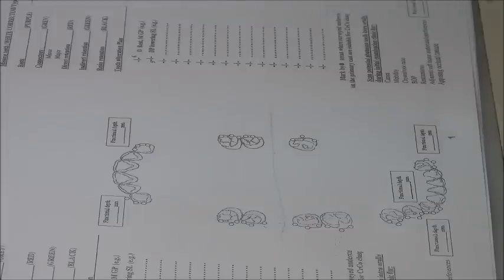What is the aesthetics? Yes, because my anterior abutment is a canine. This is the case you got in your cast. So for aesthetic reasons, I have to change the clasp. What did I change? The clasp, I change it into a cingulum rest. Will the reciprocal arm eliminate it? The guide plate, do they change it? No, it stays as it is.